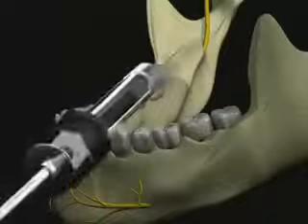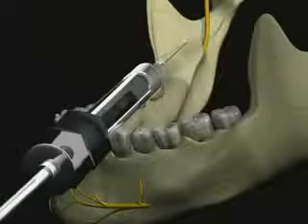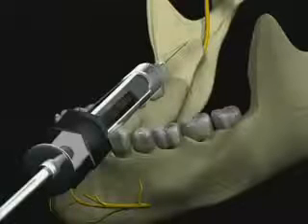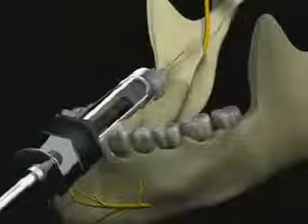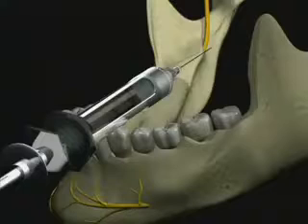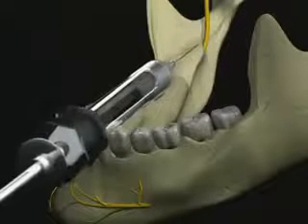If you contact bone too soon — in other words, significantly less than 25 millimeters — you will need to redirect the syringe and carry out the indirect technique. This is accomplished by withdrawing the syringe slightly, moving the barrel more medially over the contralateral canine or incisors, and advancing again until bone is contacted.